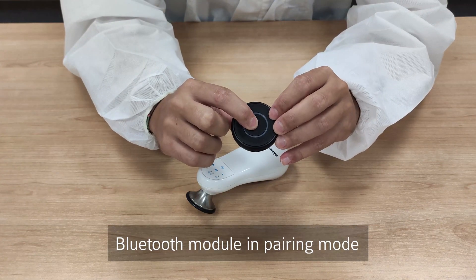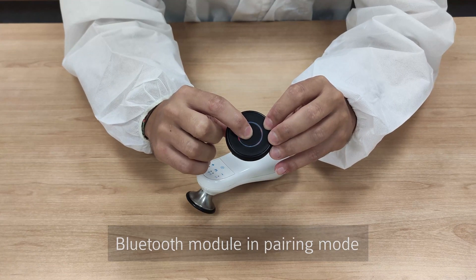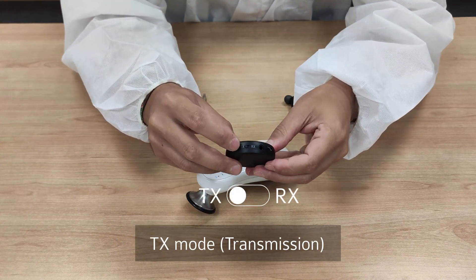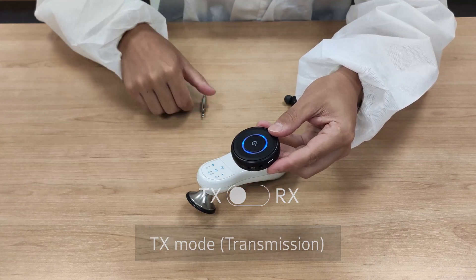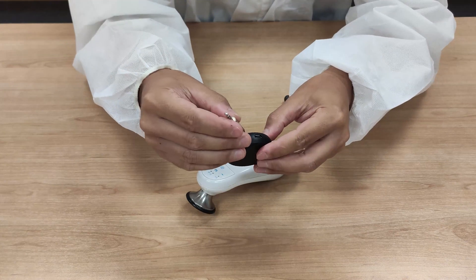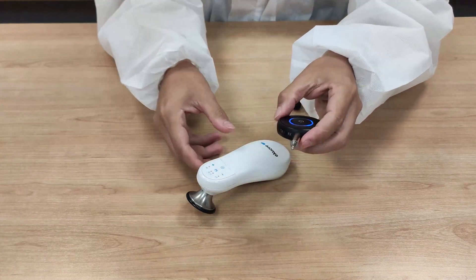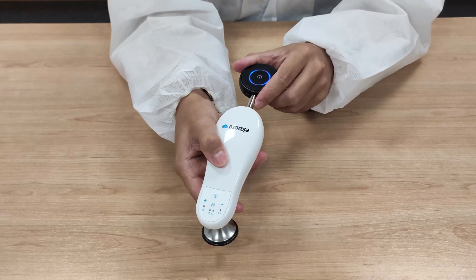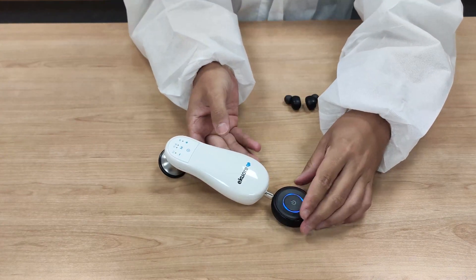Put the Bluetooth module in pairing mode and select TX mode. Once you pair the Bluetooth module, the LED light will be steady blue. Then connect the Bluetooth module to the E-Cure Pro stethoscope, and the sound will be playing immediately on the earbuds.